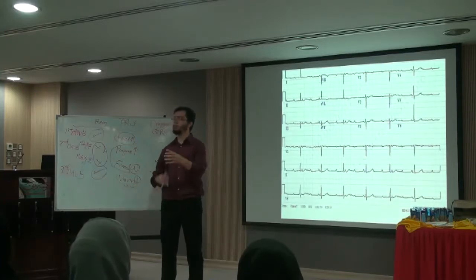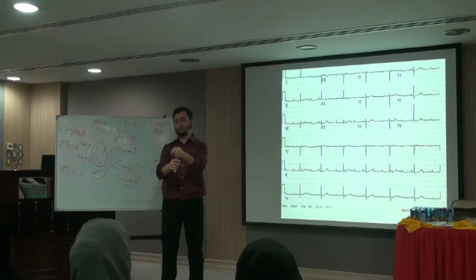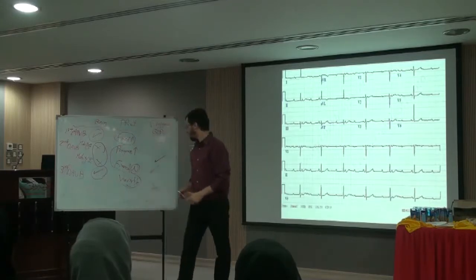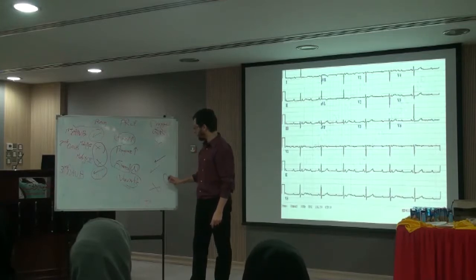Third degree AV block, now the AV node is as if it is not functioning at all. Whatever electrical activity comes from the atria, it activates the atria, comes to the AV node. Sorry, I'm not passing you. I'm completely refractory. The ventricle, how will it beat? It will beat from 2 options. This is the AV node, this is the His, and this is the right and left.